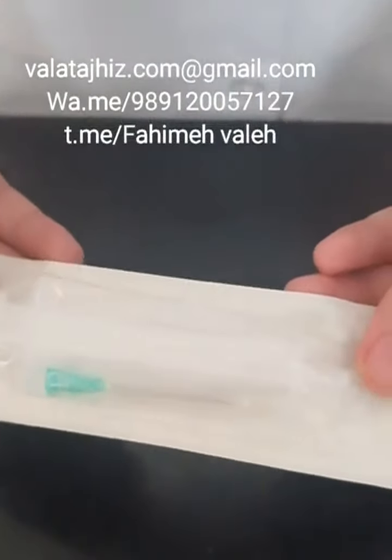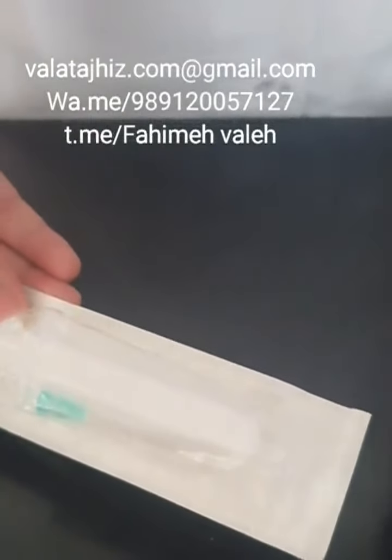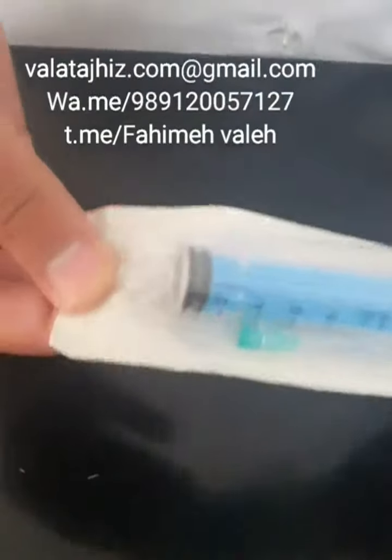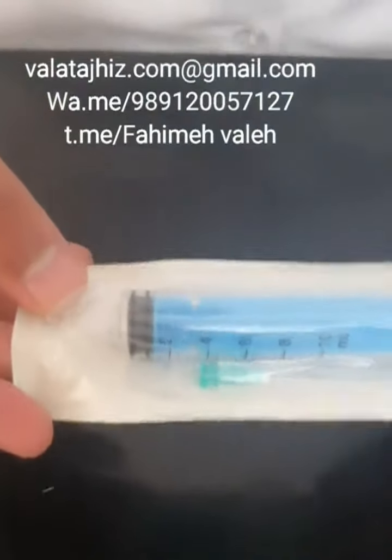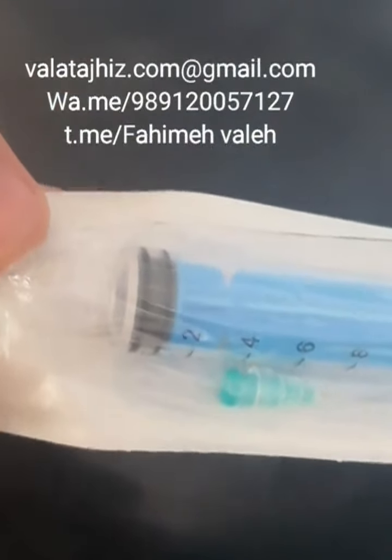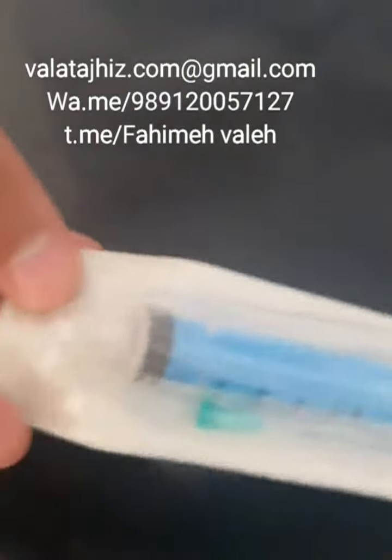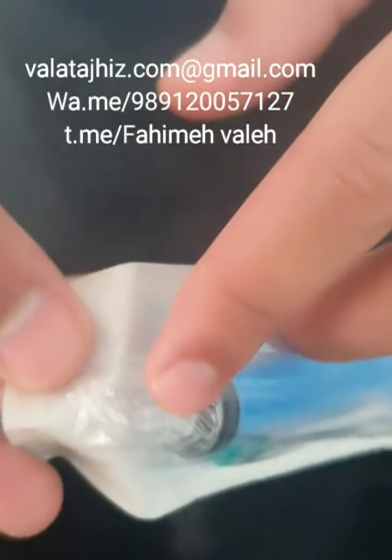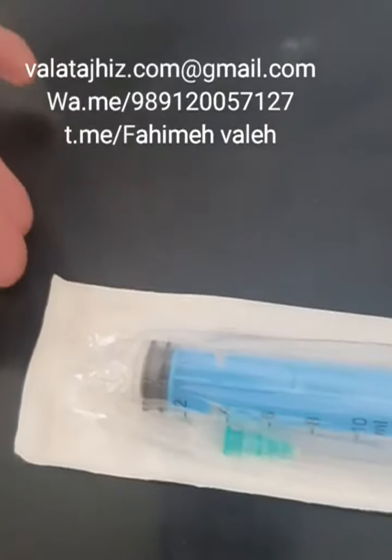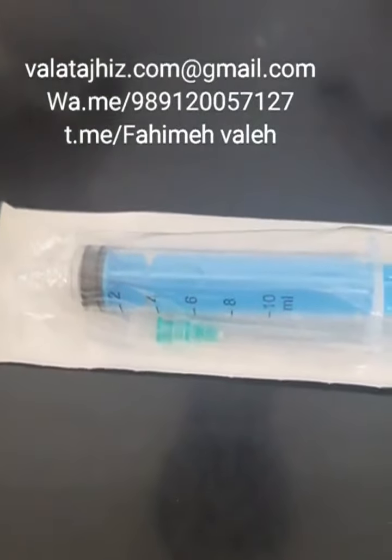This is a 10cc Luer slip syringe, and it has different sizes like 2cc, 3cc, 5cc, up to 50cc syringes. And this one is a Luer lock syringe. It's a 10cc size and it's one time use. As you can see, the needle locks here. You can buy this in different sizes also.